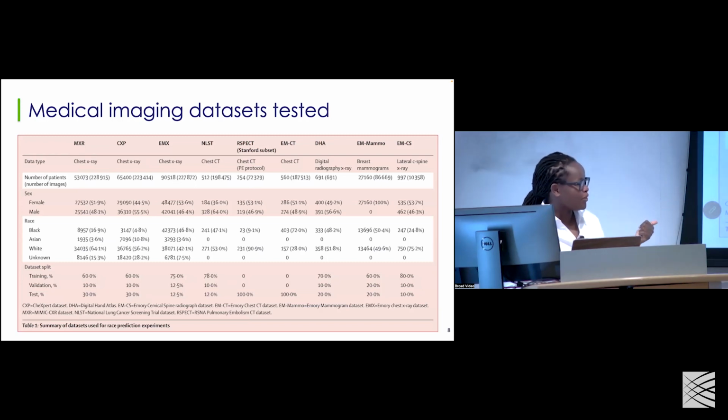And we were going to repeat the work that was done, the preamble for the under-diagnosis work that was shown. And that was going to say, hey, if you see cardiomegaly and it performs poorly for white patients, if you bring it to the Emory data set where you have a bigger, better, diverse data set, there will be no bias in cardiomegaly. We were very surprised because when we came to review the results, yes, the amplitude, the number of people who were affected in that group went down, but the patterns persisted.